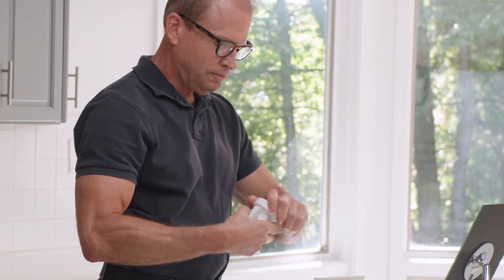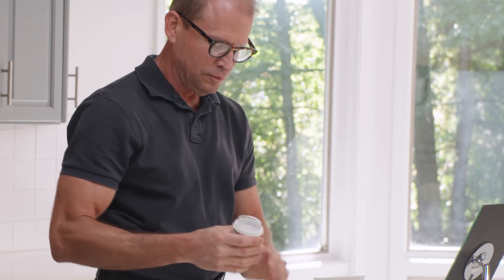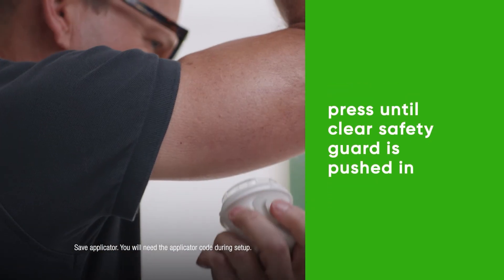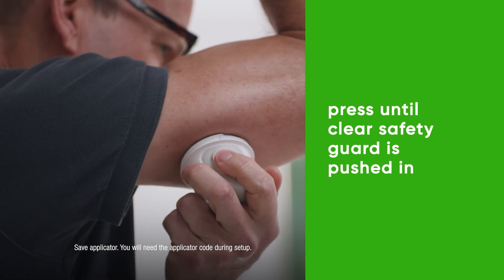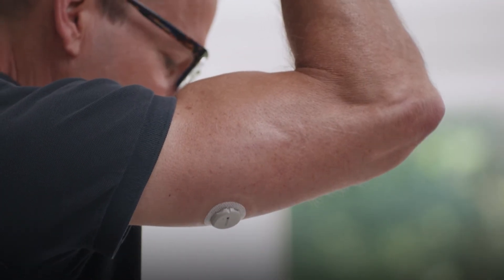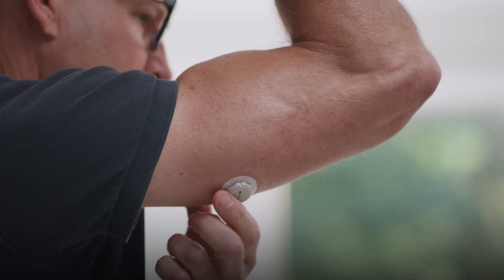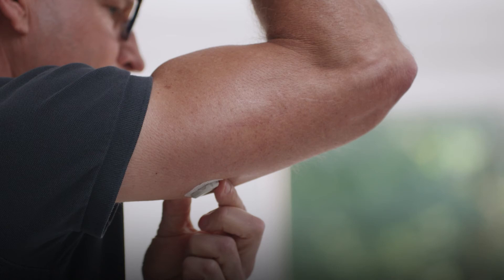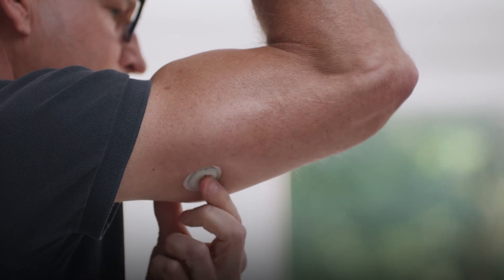Grab your applicator and unscrew the cap. Don't touch inside the applicator. Press and hold the applicator firmly against your skin until the clear safety guard is pushed in. Now push the button and remove the applicator. To help keep the patch on your skin, rub firmly around the patch three times. Then press gently on the sensor for 10 seconds.